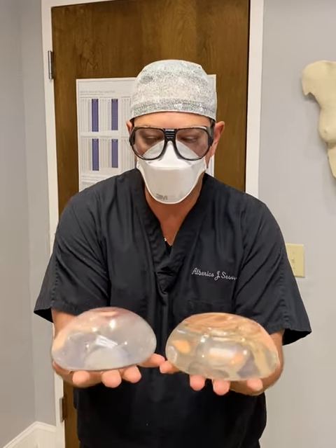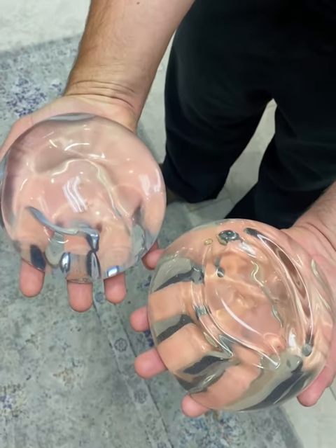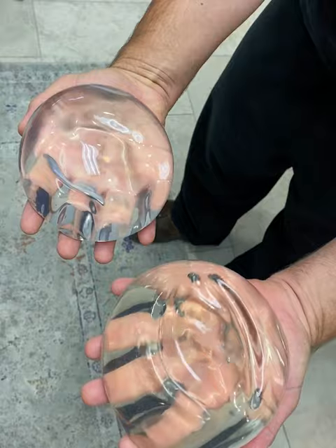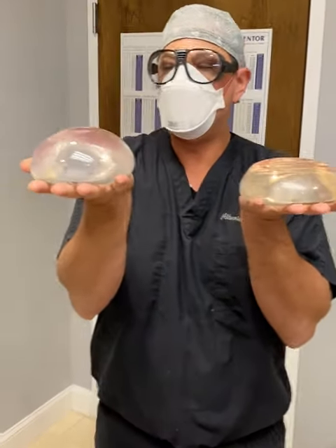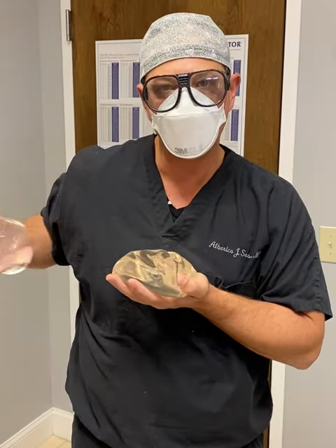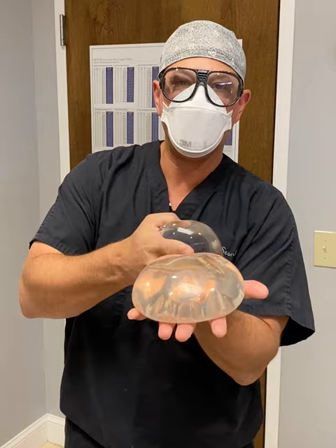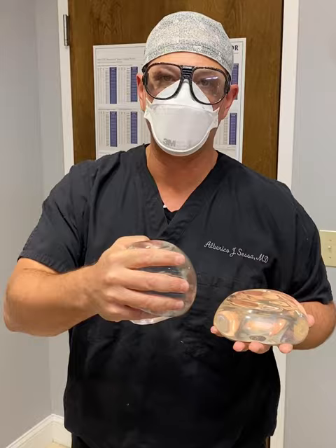Believe it or not, these are both 650cc. If you look at the size of these, you can see this one is much more narrow and this one is wider. In essence, this is going to give you a lot more projection and less width than the standard high profile, which is going to give you a lot more width and less projection.